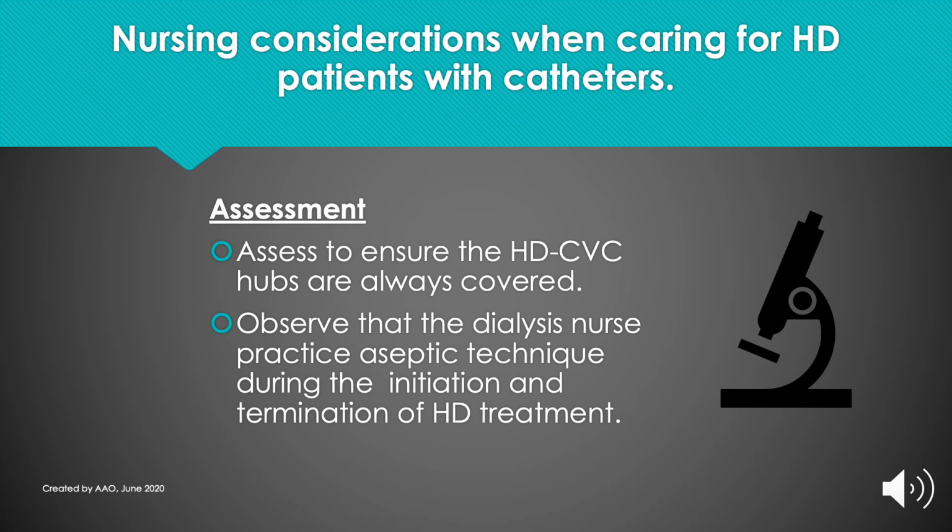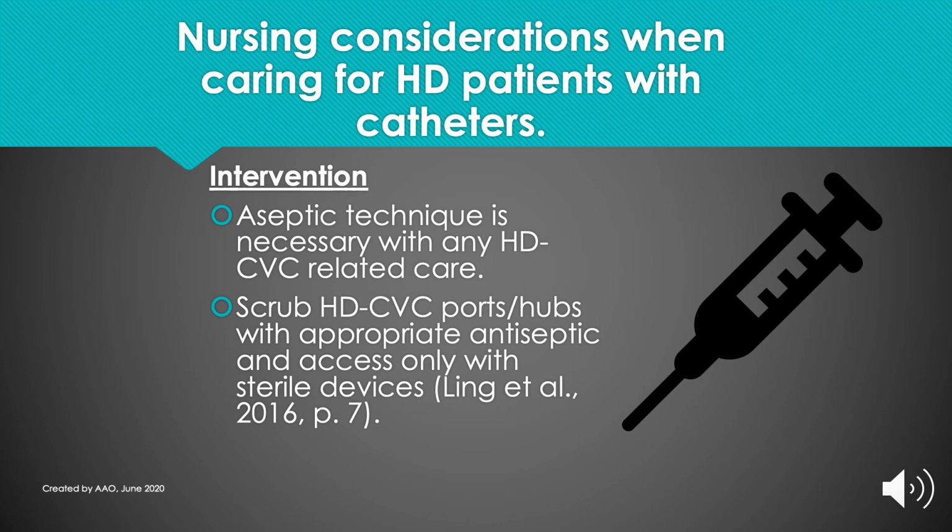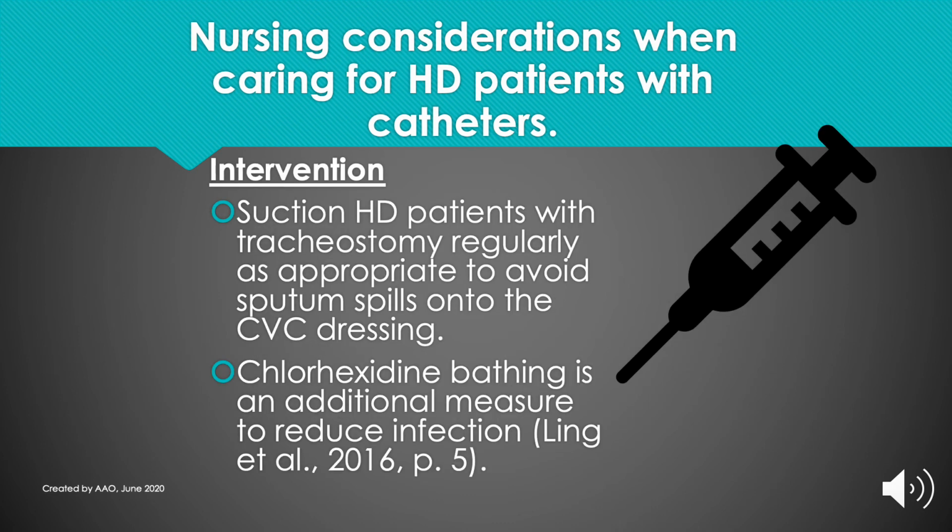Also observe that the dialysis nurse practices aseptic technique during the initiation and termination of hemodialysis treatment. For the intervention, aseptic technique is a necessity with any HD CVC related care. Scrub HD CVC ports or hubs with appropriate antiseptic and access only with sterile devices. Suction HD patients with tracheostomies regularly as appropriate to avoid sputum spills into the CVC dressing.